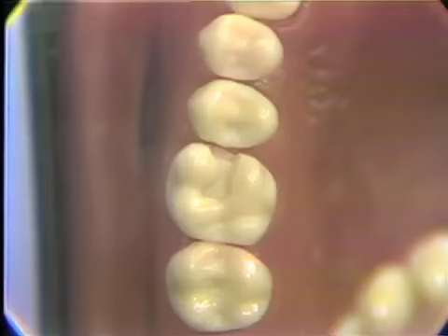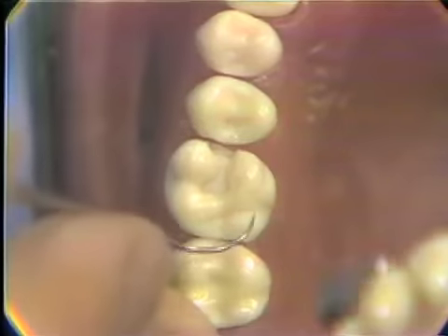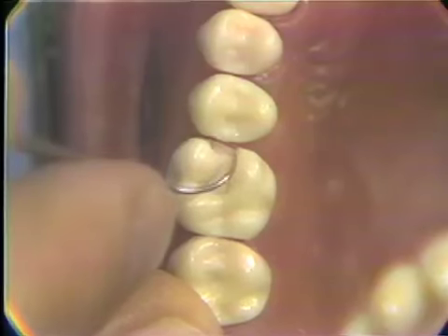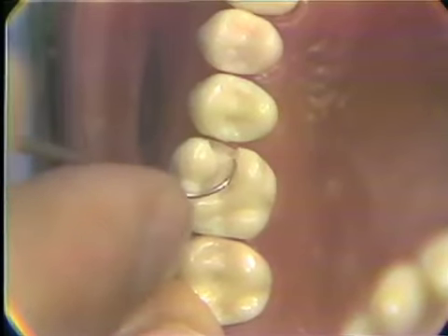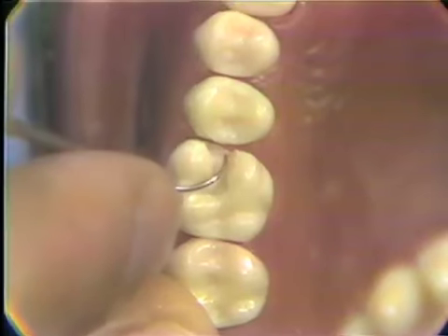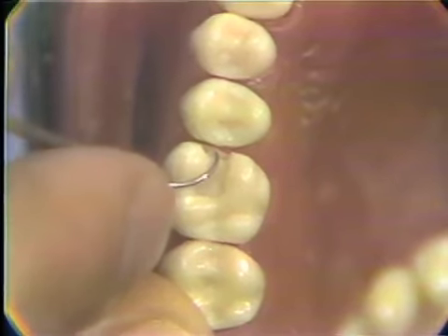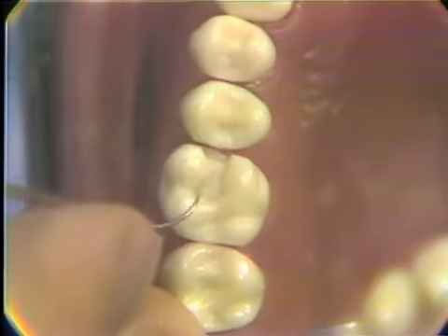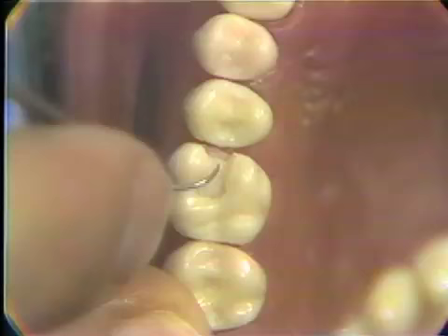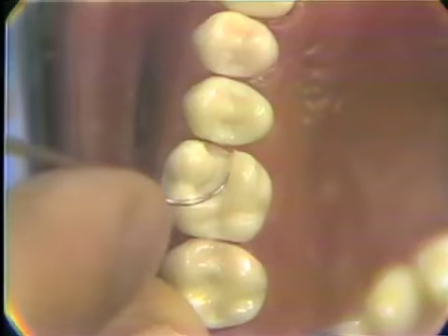If I could have a tight shot now, please. If you will notice, there are sharp line angles at the lingual and at the buccal where the slice meets the cavo surface margin of the occlusal. Now, as you look down into the cavity, you will notice that the slice does not go down through to the buccal nor to the cervical. You can see it in this shot. There's a little tiny bit of an indentation that you can notice here if you look very closely, especially on the buccal.